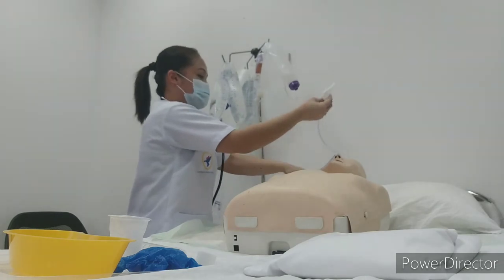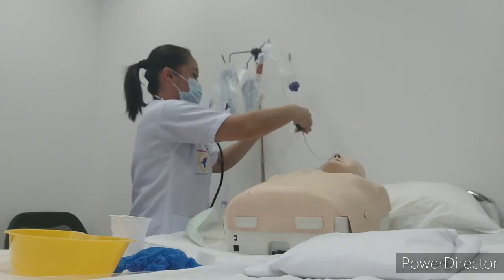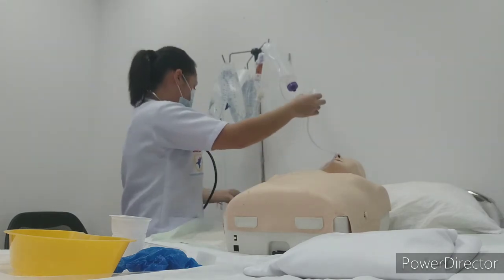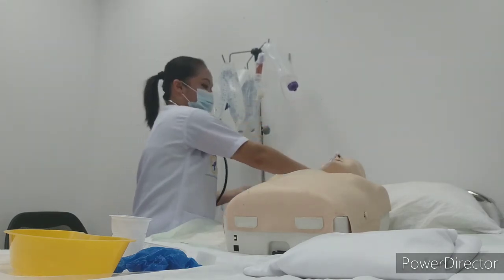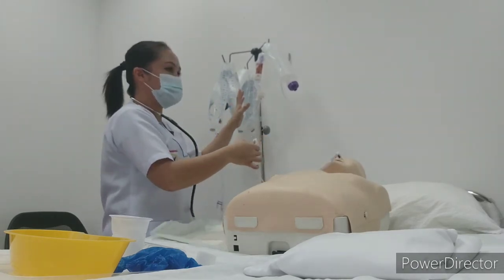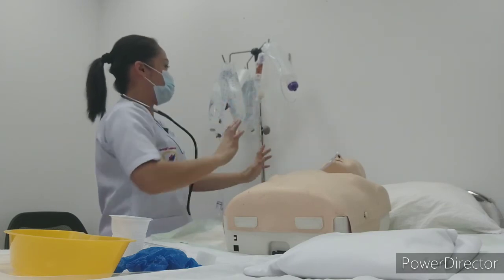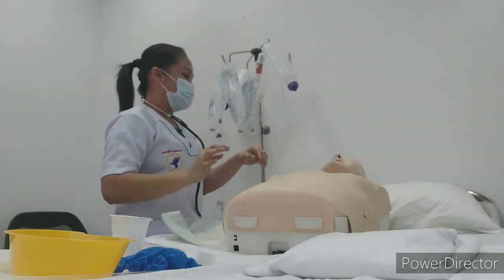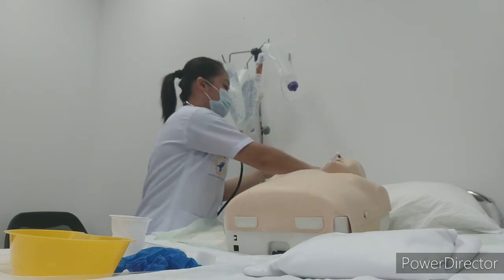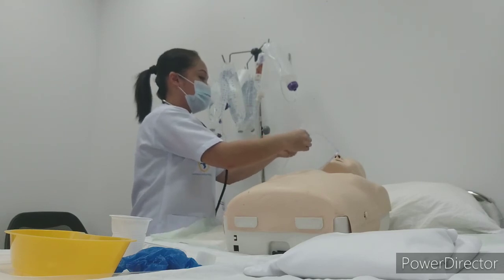So now we'll put the gauze and then connect this one. So okay, we will do like this, and then we will open, start the feeding. So we will just wait until it will finish. For example, only 500 ml. So we will wait until the 500 ml finish. So now it's okay. We will close this one because there's still another 500 remaining. And we will again disconnect this one, pinch, disconnect, and then close.